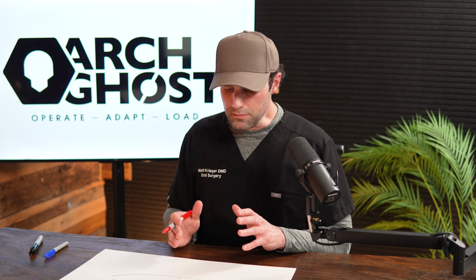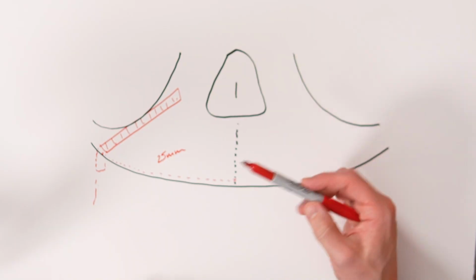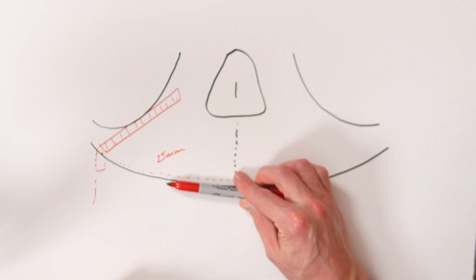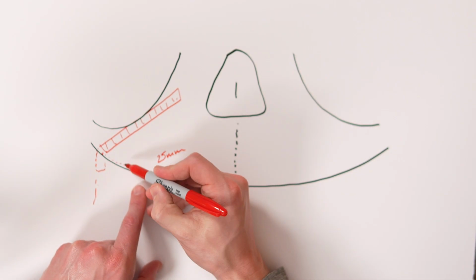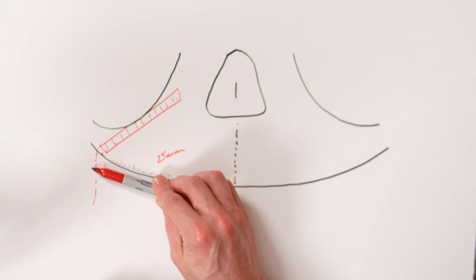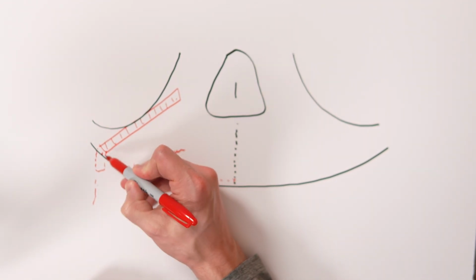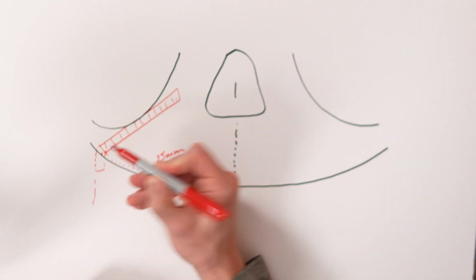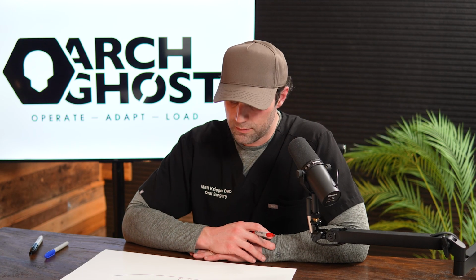All right. Then intraoperatively, I simply take my sterile graphite device, mark the midline. I use a perio probe. I just lay the perio probe here, 20 millimeters, and then the perio probe I use is 20 millimeters in length. So I would mark where that 20 millimeter mark was, and then I would lay the perio probe again and mark that additional 5 millimeters, and then I will mark, on the site here where that 25 millimeter mark is, and that's where I will start my osteotomy.